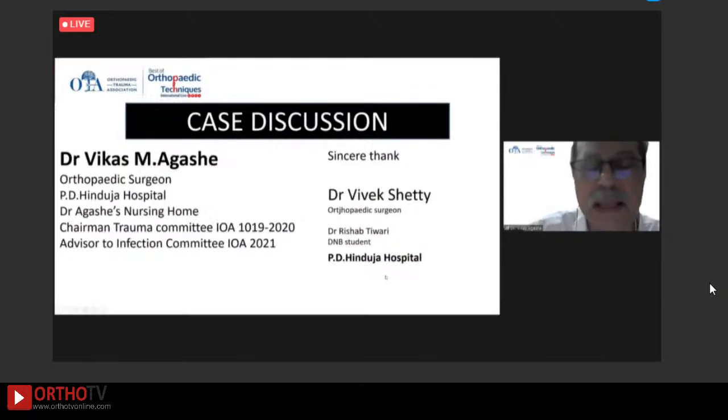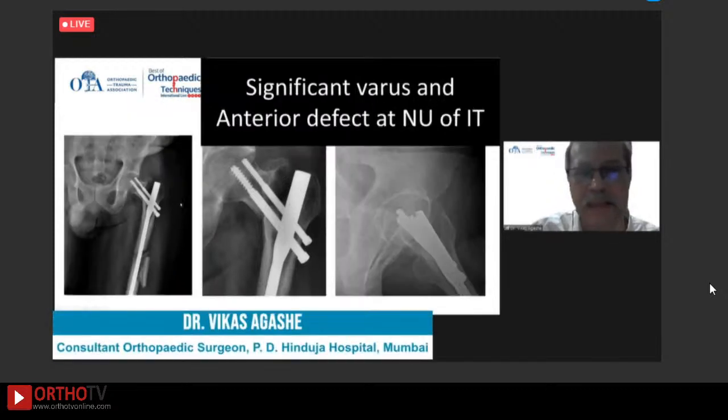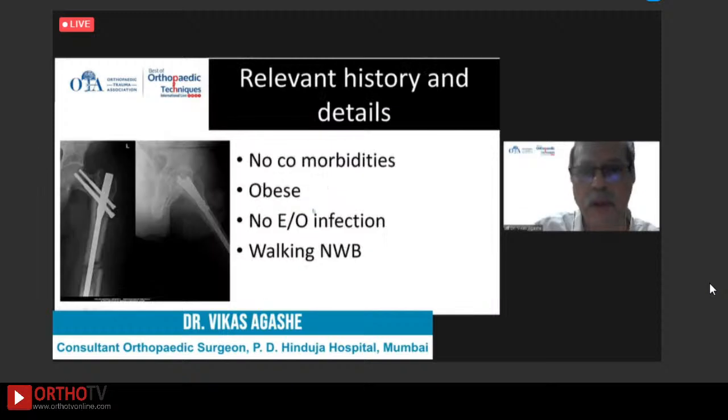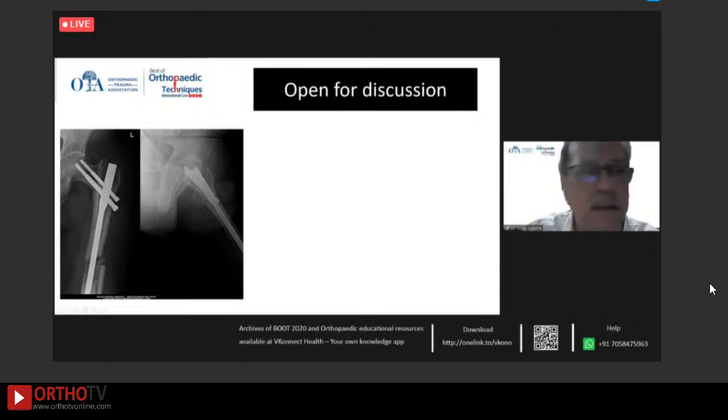Thank you. A relatively simple case as compared to the real complex cases that were discussed. So this is a Scottish man presented with non-union of intertrochanteric fracture. You can see at the greater trochanter here, there's a big gap and non-union of the shaft. You can see there's a significant varus and anterior defect at the non-union. No comorbidities, a bit obese person, no evidence of infection, and he has been walking non-weight bearing. So here we have a non-union of intertrochanteric fracture following an implant with a varus and an anterior gap. So may I invite suggestions?